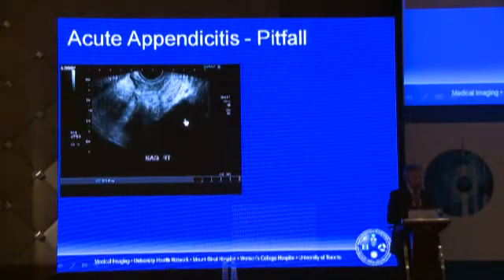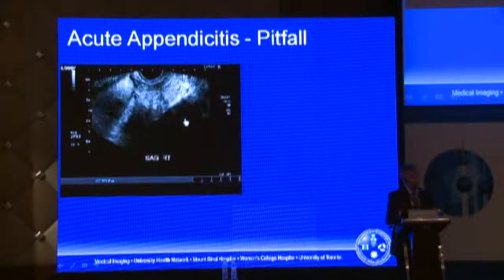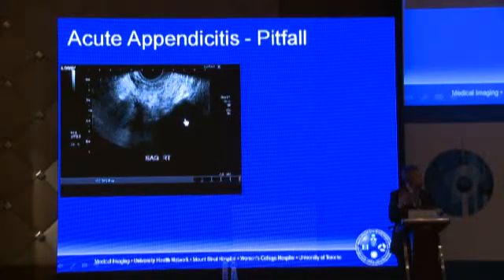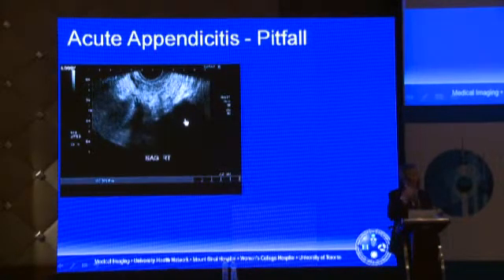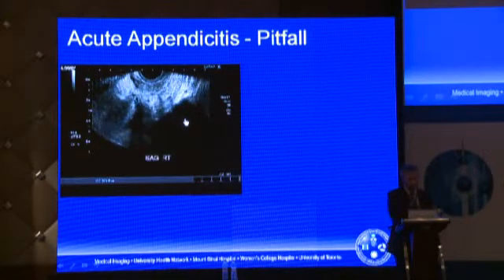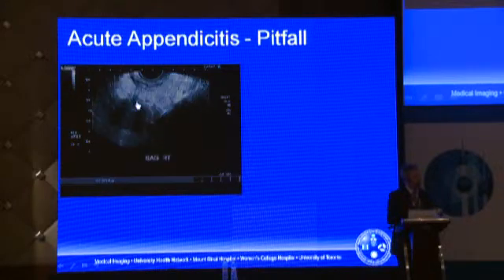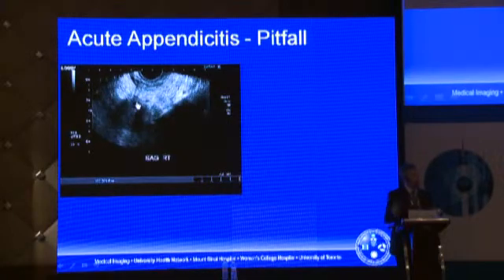Here's another example. Most of these images, by the way, are from our technologist team. A patient came with acute right lower quadrant pain, and no patient leaves the room without us reviewing the images. And I invariably go in at least to speak to patients with acute pain from the emergency room. But an experienced technologist said, you know, I think I've seen a normal appendix, but it's very short and I can't really connect it to the cecum. So I got up off the chair, went in.